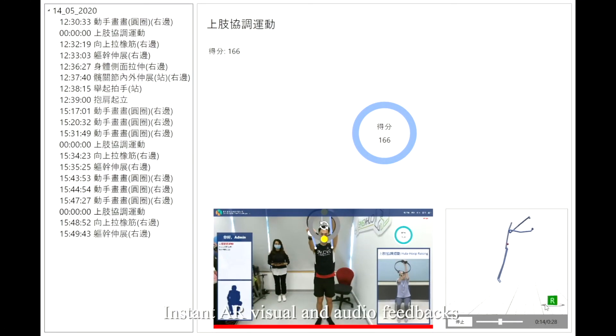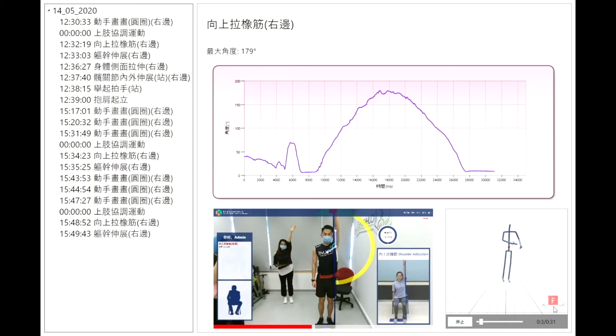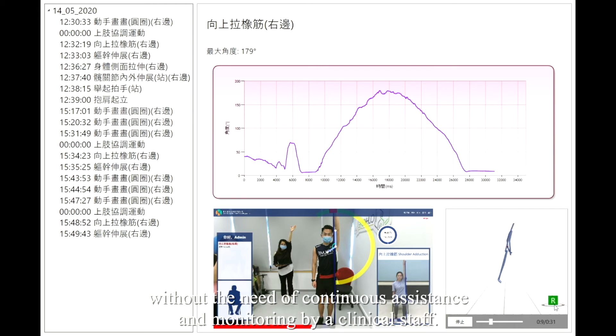Instant AR visual and audio feedback assist the users to complete the exercise tasks correctly, without the need for continuous assistance and monitoring by clinical staff.